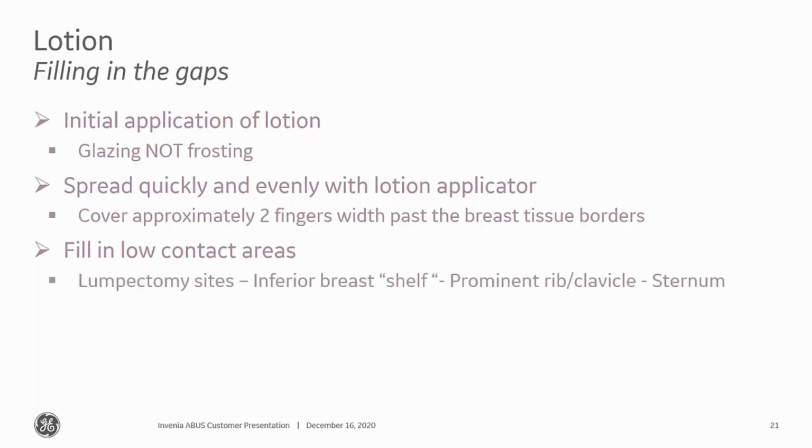And then you'll want to fill in those low contact areas at the lumpectomy site where you have little divots or areas of low contact, because you want to make sure that that membrane is going across the breast tissue. You just want to make sure you have contact.